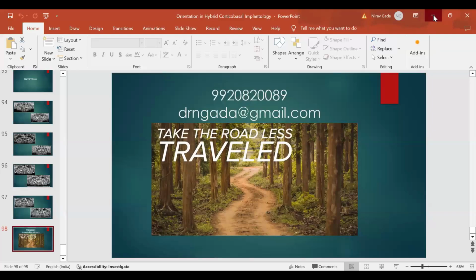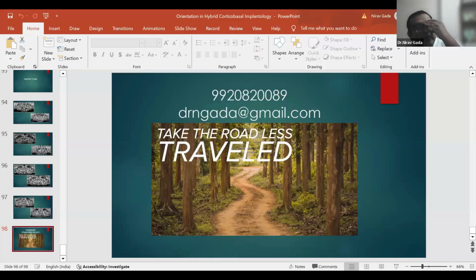Hi, doctor. We have a few questions here. The first question is, what are 30 drills specifically used for? Generally, 30 mm is the length, and the width is 2.0. The 30 drills are generally required for the pterygoid bones.